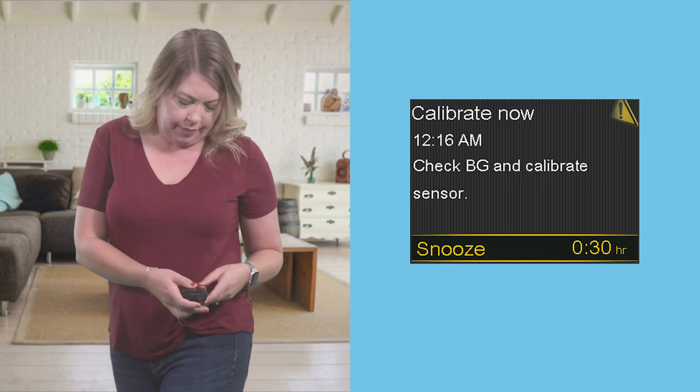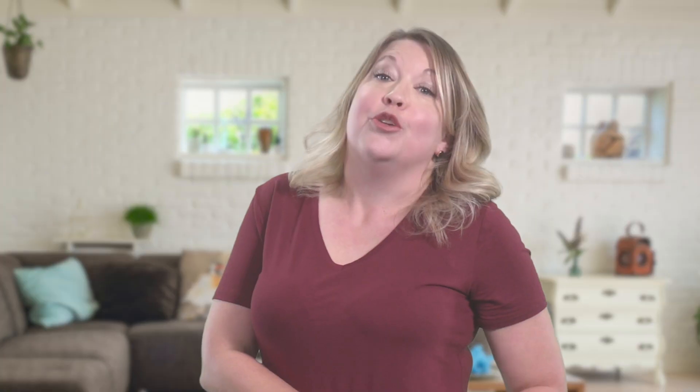I found the system works best when I do three or four calibrations a day when my glucose is stable. For example, I like to calibrate before bed and before I eat. When your pump and sensor need a calibration, you'll receive a message that looks like this on your pump screen. You should get these alerts more on the first day of wearing your sensor. That happens so your sensor can get more accurate readings on the first day, helping it track you better throughout the remaining six days of wear.